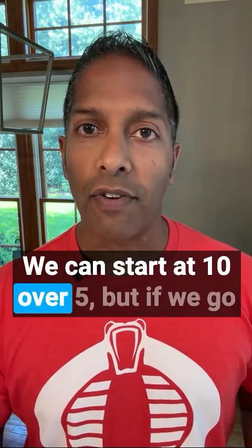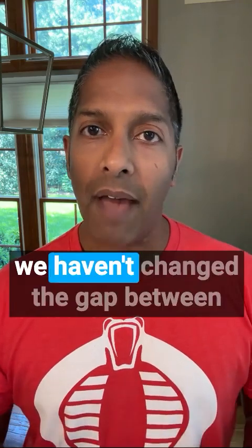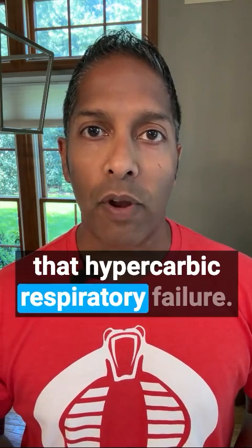We can start at 10/5, but if we go from there to 15/10 to 20/15, we haven't changed the gap between the EPAP and the IPAP, and so we're not improving the tidal volume the patient's getting, and we're not going to relieve that hypercarbic respiratory failure.